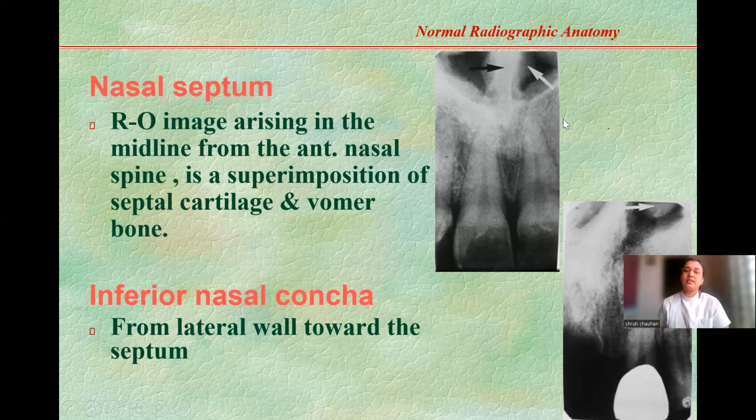Do those X-rays have any extra structure to pass through or any less structure to pass through? Extra, right? It's the nose, extra structure that has come in. So the X-ray will pass through that. So how is it going to appear? Any extra structure X-rays pass through will appear white, right?